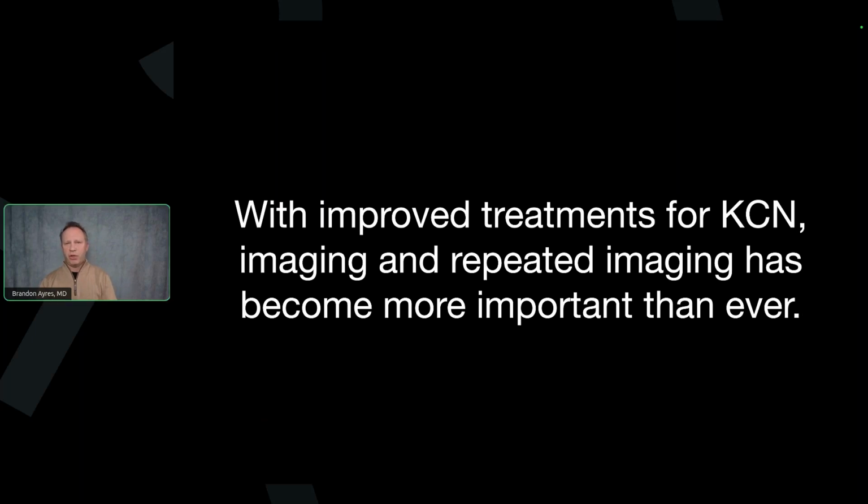With this renewed interest, catching keratoconus early and stopping it matters. Being able to map the cornea, look at some metrics, and track progression has been really critical. The old story I would tell patients was, you've got keratoconus, we'll see what happens, and if you need surgery, we'll do it. That has now changed to, let's get you in early, let's get some diagnostics, let's see if we need to stop this from progressing, or let's definitely stop this from progressing. And if you've already progressed to a point where you're not happy with your vision, we may have some less invasive procedures to try and get that vision back.